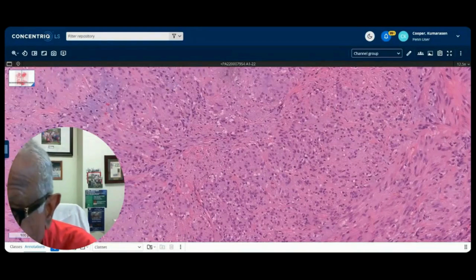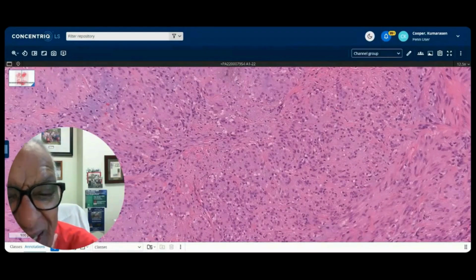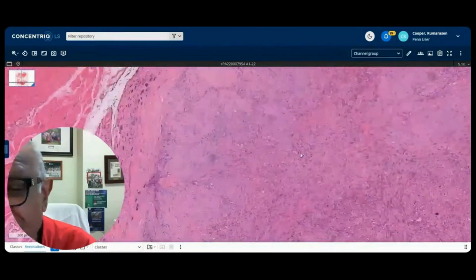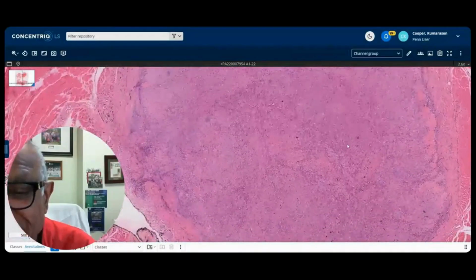Feathery look? Yeah, not quite, but with the erythrocytes, yeah, I hear what you're saying, but all of my other immunos were negative, and that was my best morphological interpretation, along with the sclerosis and along with the lack of USP6 signals. It was the only way I could interpret that.